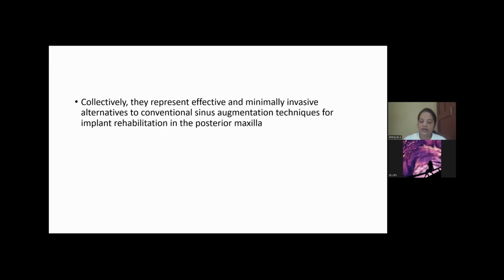So this is a minimally invasive technique, which is an alternative to the conventional technique that we follow. While it has its own restrictions, that is, only when residual bone height of between 5 to 10 mm is present can we go in for this minimally invasive technique.